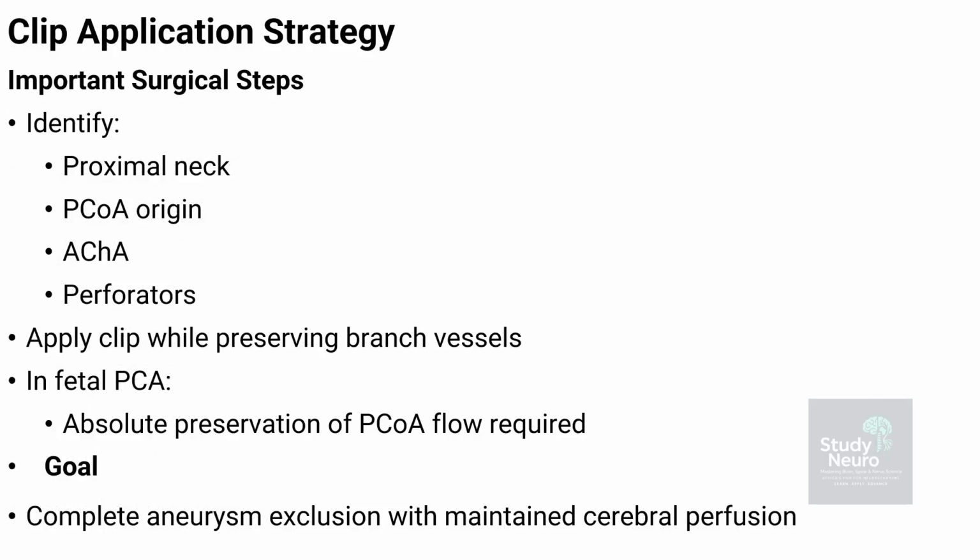Clip application in posterior communicating artery aneurysms is a precise step where anatomy must be clearly understood before any permanent closure is attempted. This is the moment where small mistakes become permanent. No pressure, but high stakes.